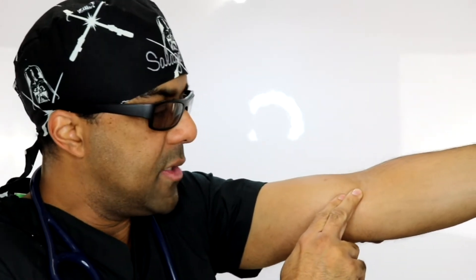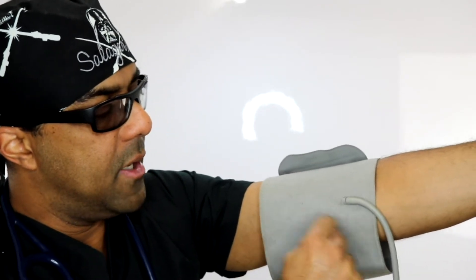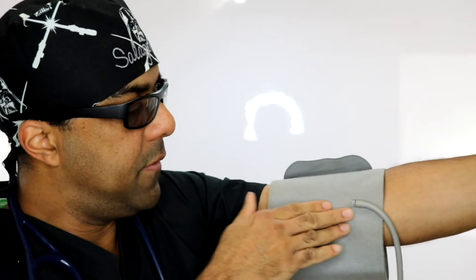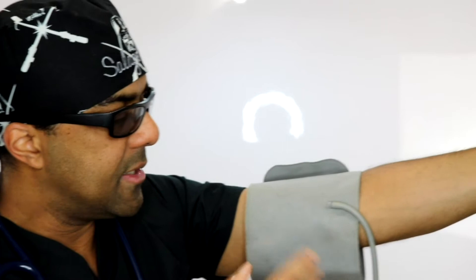Now, another thing to realize: if you put your fingers there yourself — just like you can feel your pulse in your neck — you can feel the pulse in your brachial artery right there. That is where you want the bell or diaphragm to be adhering. Demonstrating with this cuff from an automated machine, you can see I have it pressed up against where my brachial artery is, so the little diaphragm is right over the artery.